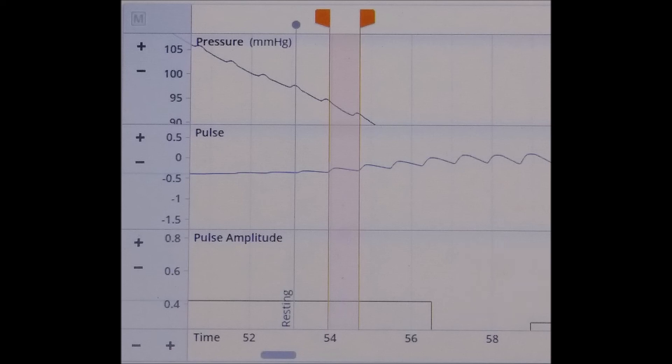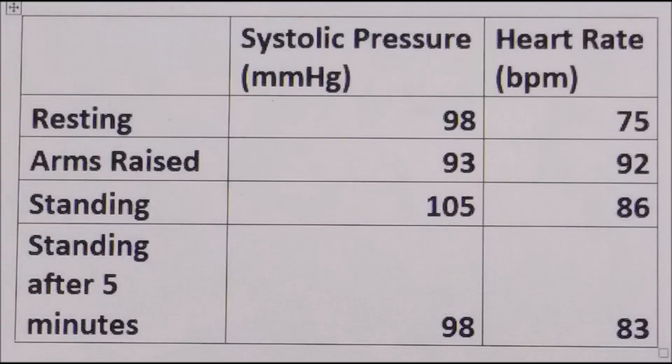Shortly I will provide a completed data table showing the systolic pressure as well as the patient's heart rate for each one of the four conditions. Here's the final data table comparing the systolic pressure in millimeters mercury with the heart rate of the patient in beats per minute under the four conditions: Resting, arms raised continuous for two minutes, immediately after standing from resting position, and after standing still for five minutes.